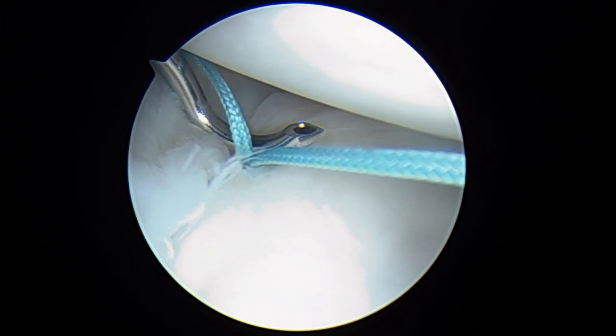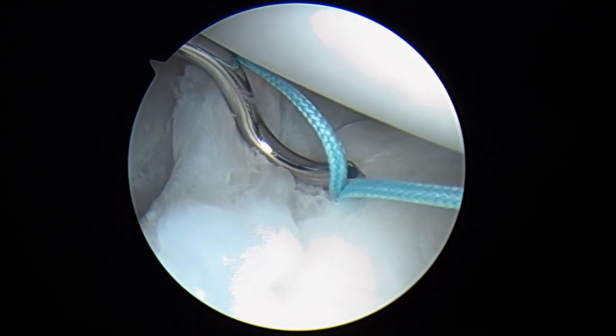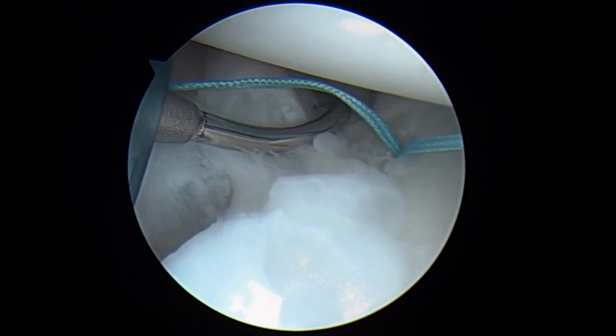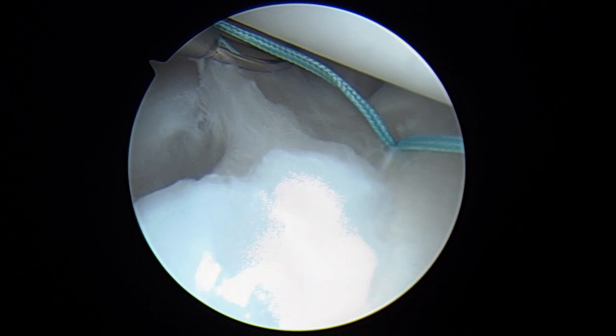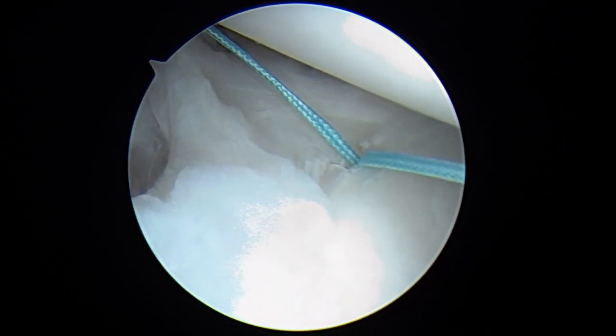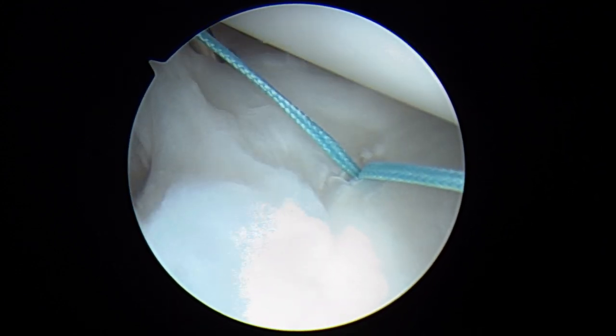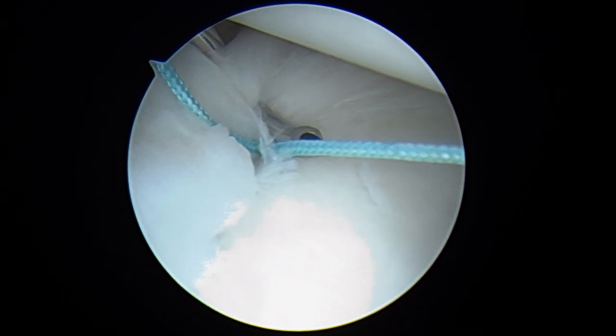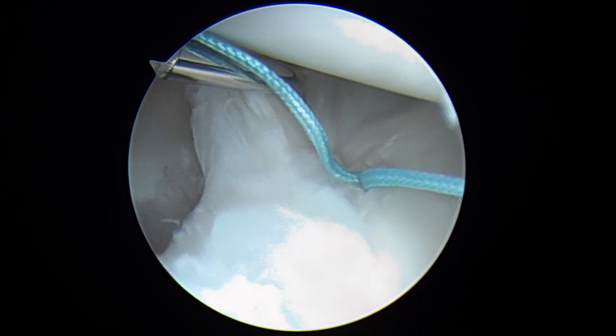Here's our turn-to-the-right suture hook — you can see where we are. We're going to rotate back and get a bite right into this ligament here, like so. And there we are — that's a pretty good bite of that ligament, and we're going to bring this underneath.